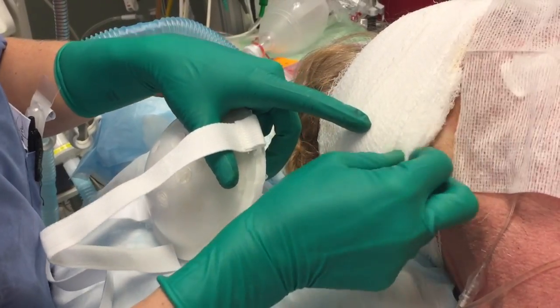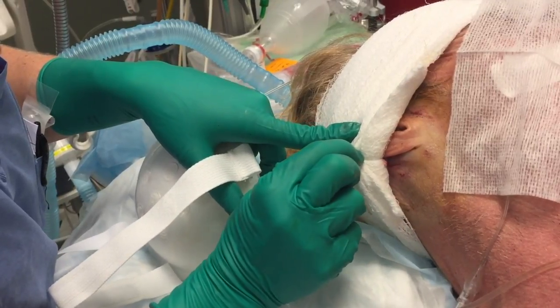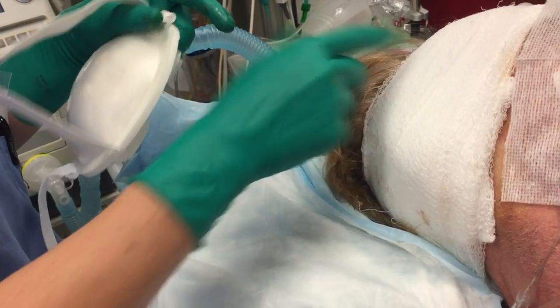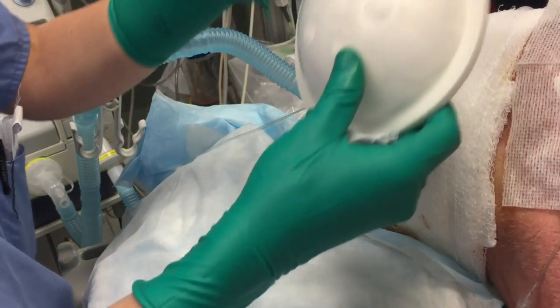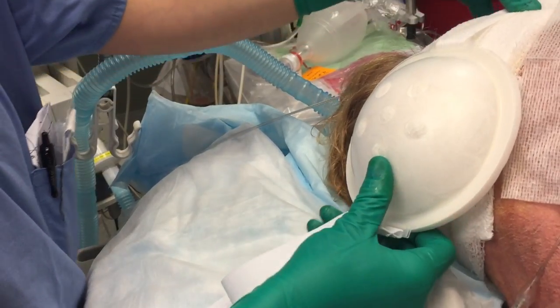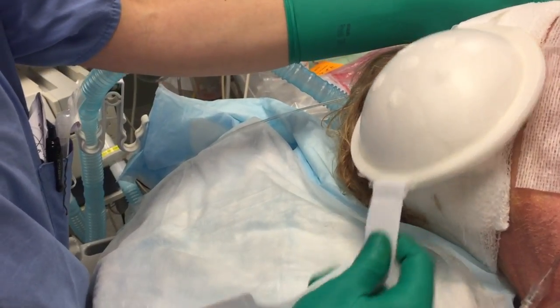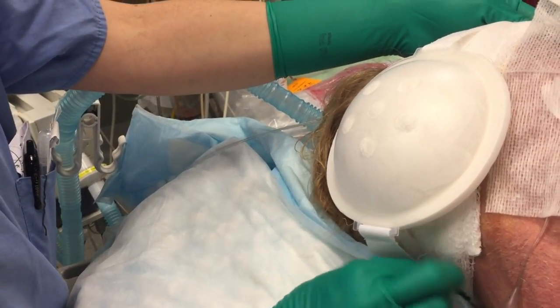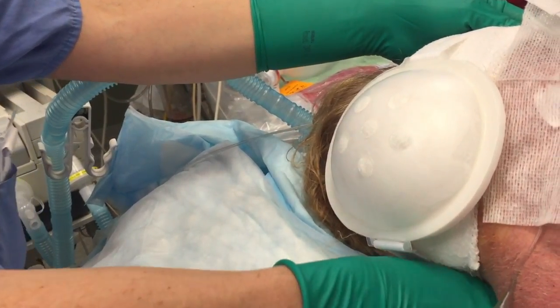Lastly, the patient's ear is packed with fluffs and a hard ear dressing. The patient should be prescribed anti-staphylococcal antibiotics and instructed to check the area for vascular compromise, infection, or both. The patient should be re-evaluated within 24 hours to look for re-accumulation of the hematoma or signs of infection.